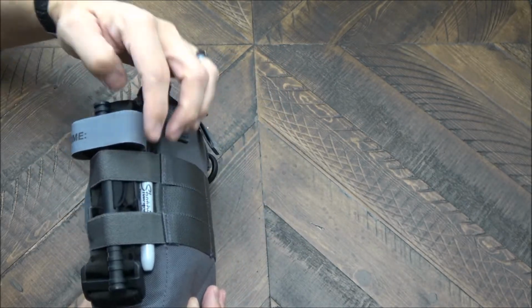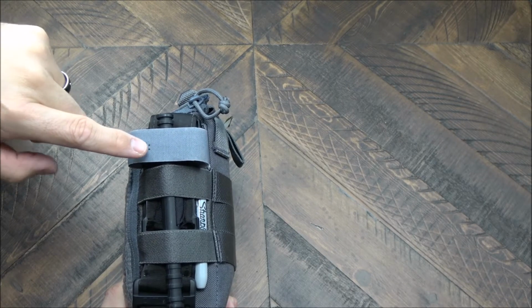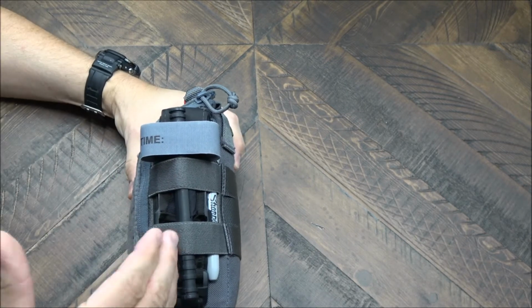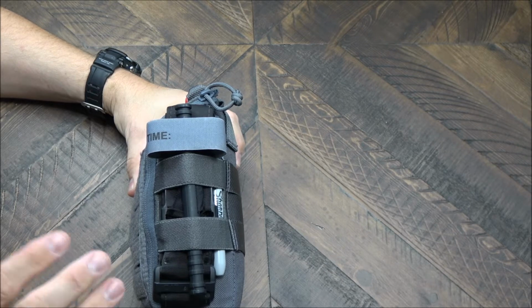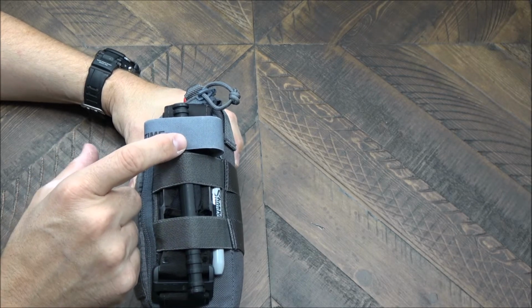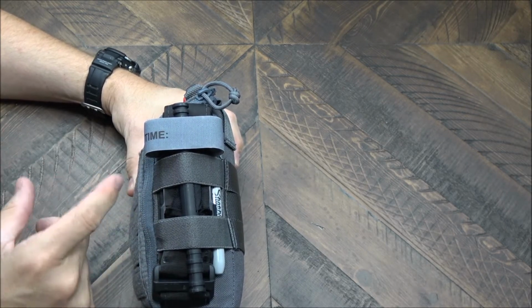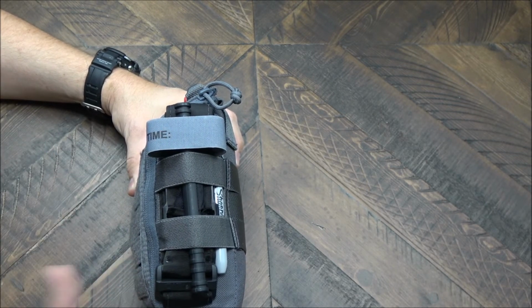So I always keep a Sharpie, but the Sharpie is specifically here to write the time that the tourniquet is applied to a patient. That is going to be critical once this patient is moved to a higher echelon of care, and goes to the hospital. They need to know how long that tourniquet's been applied to that patient. Whether you write it on the patient's forehead, or both the patient's forehead and on here, it's critical that you put the time down. And that's exactly what this is for.